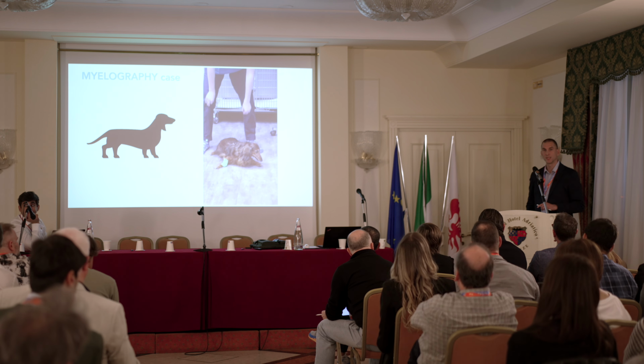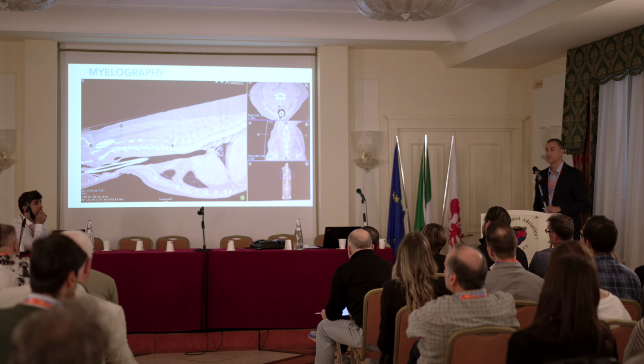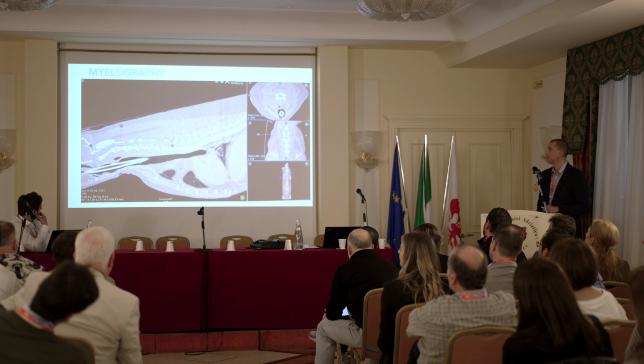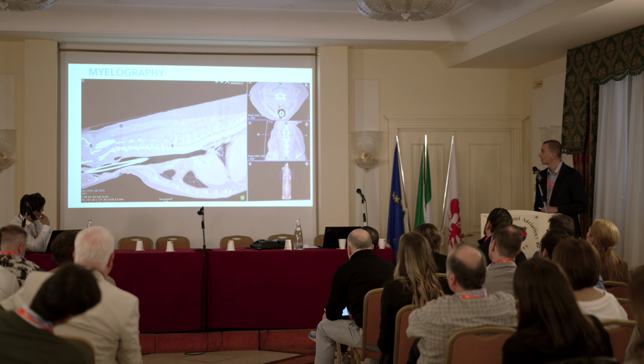We are here for CT, so we perform plain CT. Can you see some kind of anomaly on this vertebral channel? No? Yeah, it was not very nice to interpret this case on the plain survey native CT image.